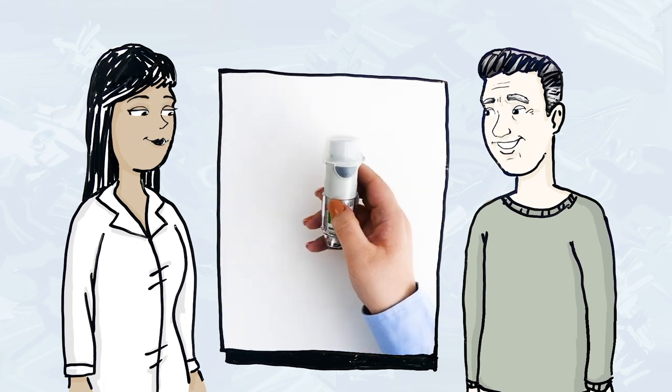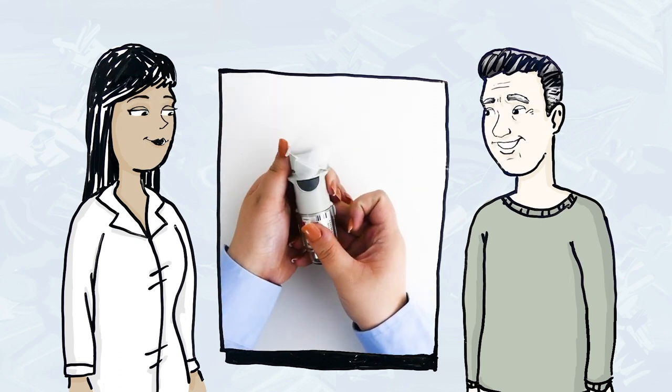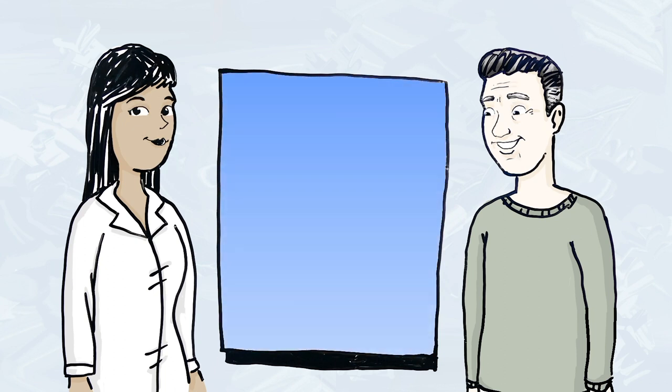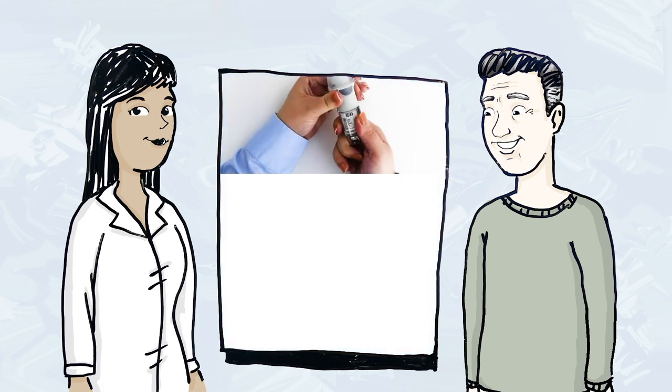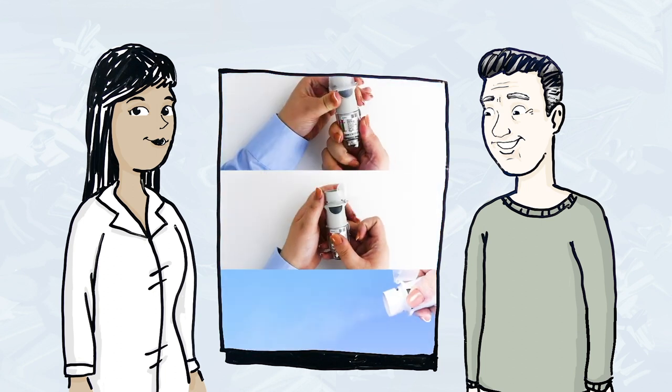we push up on the circular opening tab until the cap snaps fully open. With the inhaler pointed toward the ground, we press the dose release button. We then repeat, turn, open, press with the inhaler pointed toward the ground until there are four mists released from the inhaler.